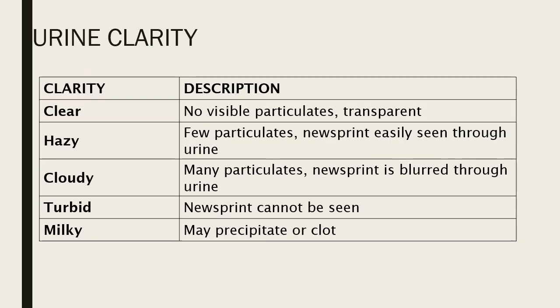Of course, you have your urine clarity. How do you check on your urine clarity? You visually examine the sample in a clear container while holding it in front of a light source. That is why a translucent urine container is advisable to use.